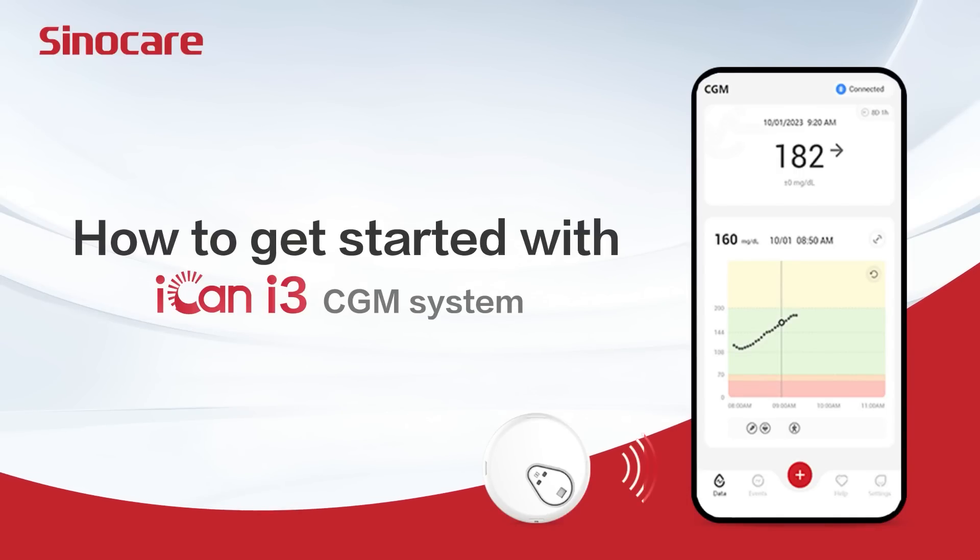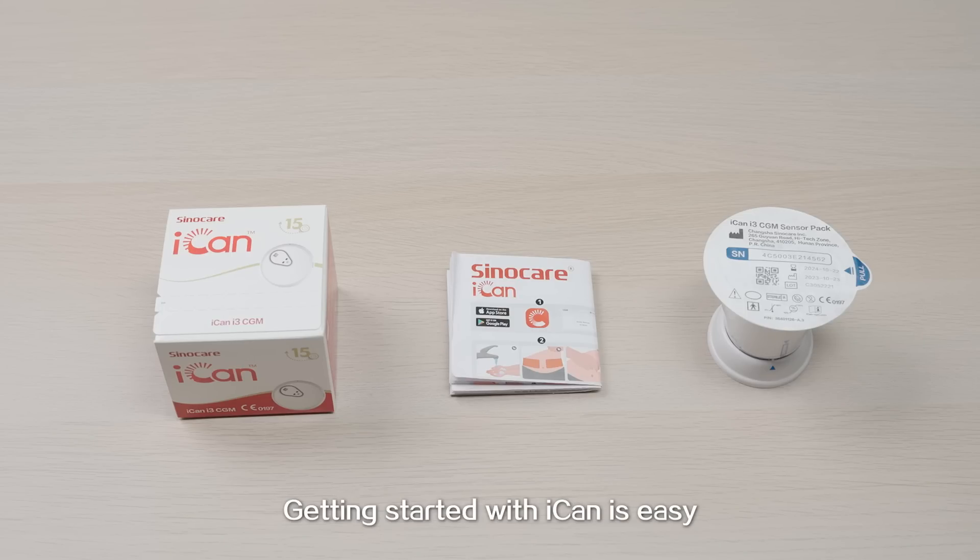How to get started with iCan i3 CGM? Getting started with iCan is easy.